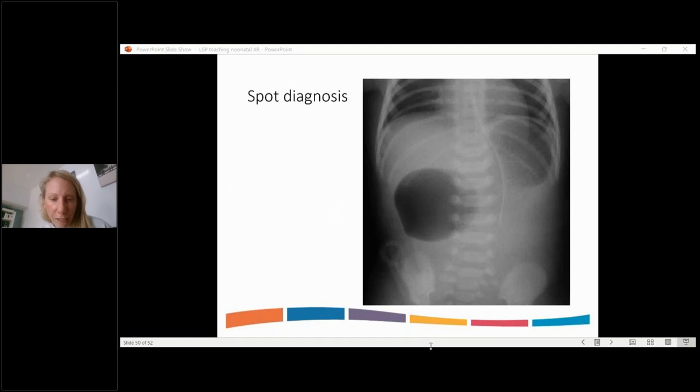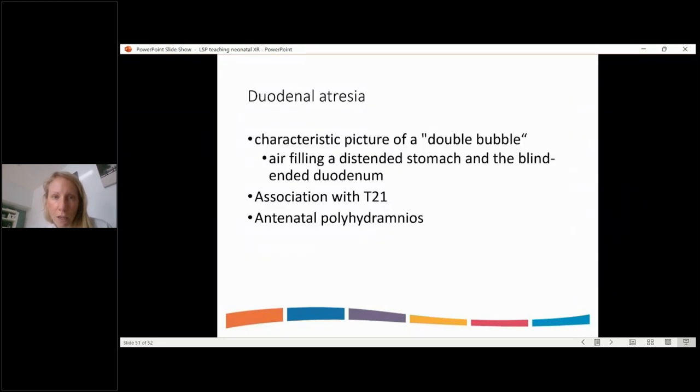So I can see why some of you have said abdominal mass, which, number one, it's a good thing that, A, we know this X-ray is abnormal, right? But can we clearly see that there is a stomach bubble here? An NG tube that is going probably still into the stomach, but a bit low, and then another bubble here, and they appear to be completely separate. And that is your double bubble presentation. And this is probably one of the few X-rays where the one you see in typical textbooks describing it is what you will see in real life.